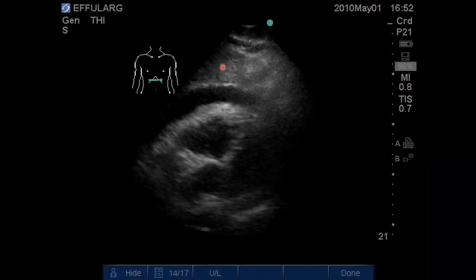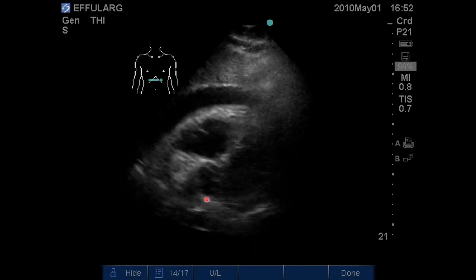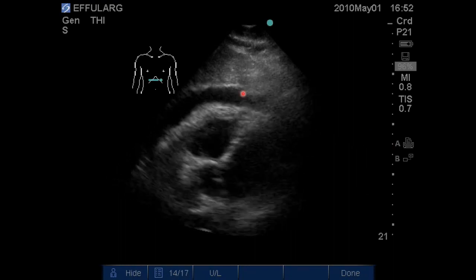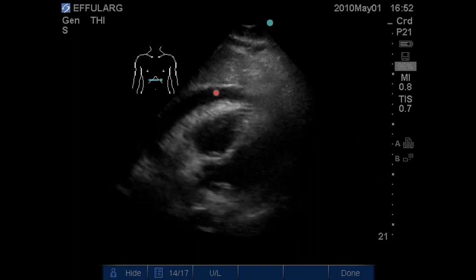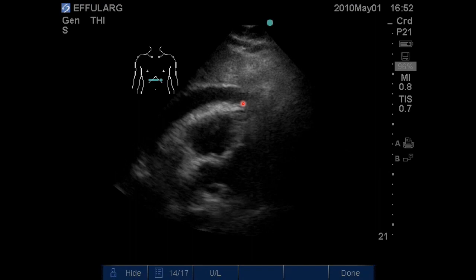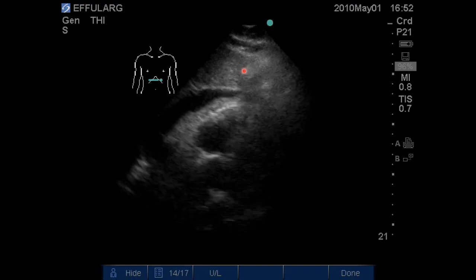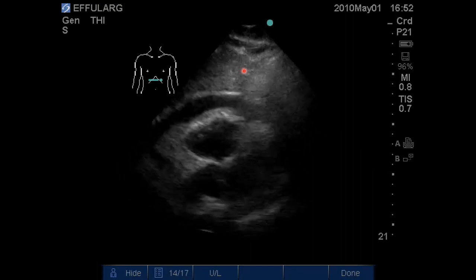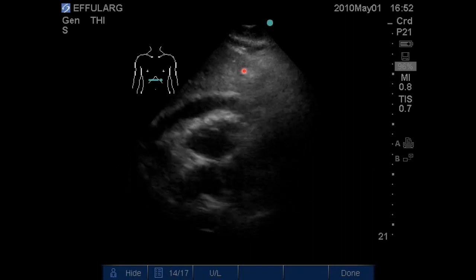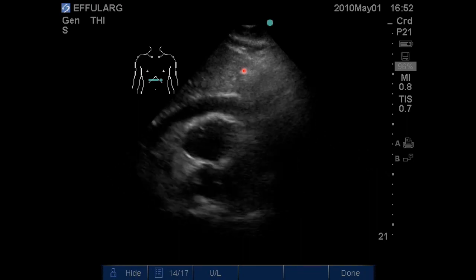So again, liver here, and you see the heart kind of struggling to pump and not pumping in coordination because you have this huge water balloon around your heart right here, you know? And if you're able to see that and identify that, then you're able to identify a positive, problematic eFAST exam, okay? And that's what this curriculum is built about. See if you can see normal and then if you're able to identify free fluid in the abnormal sites, okay?